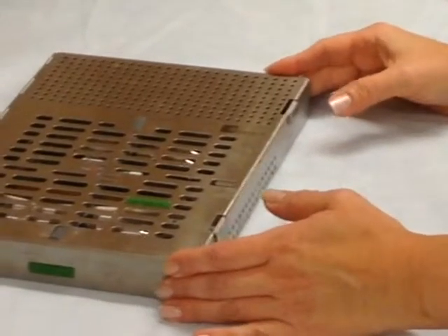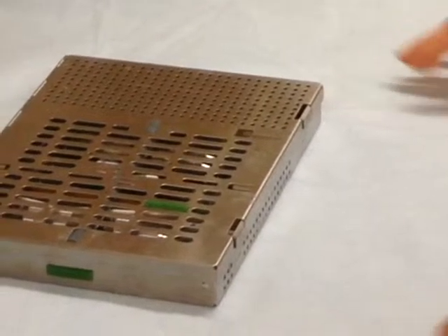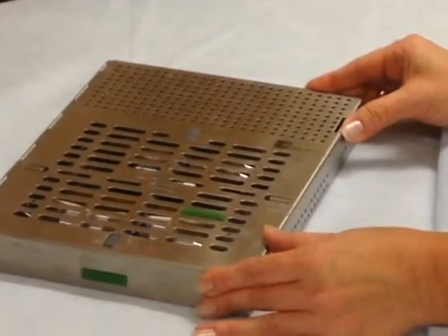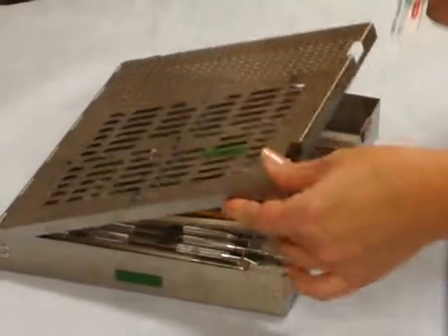I'm going to demonstrate how to wrap an instrument cassette with the envelope fold technique. I have the wrap here, the cassette, and I place inside the cassette the indicator.